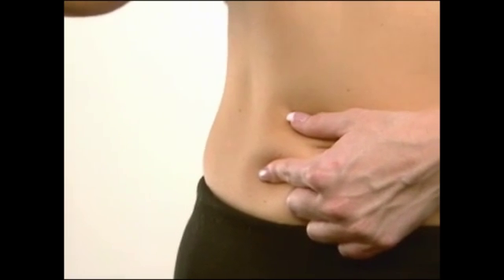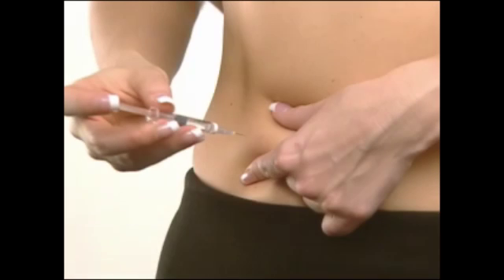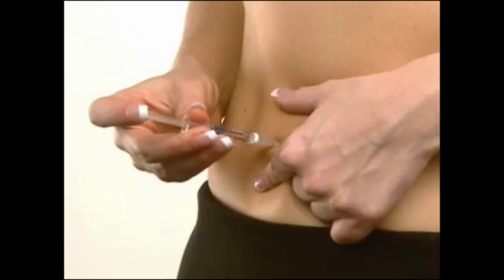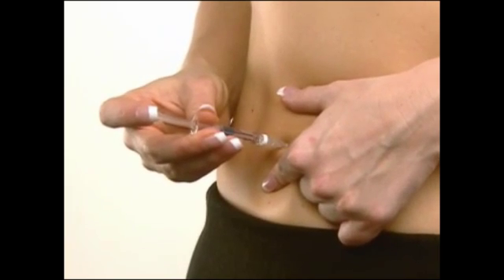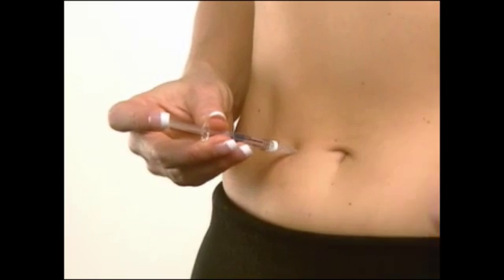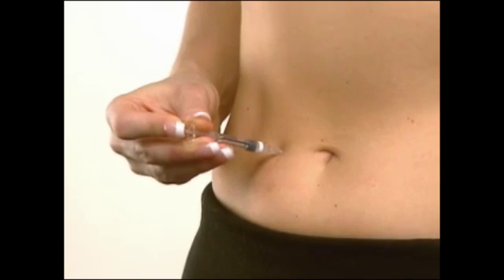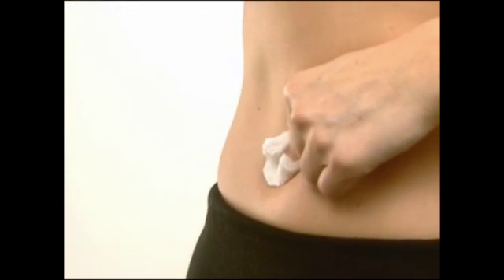Uncap the injection syringe. Hold the syringe in one hand the way you would hold a pencil. With the other hand, pinch the skin around the injection site. Insert the entire length of the needle completely straight into the skin at a 90-degree angle. Once the needle is inserted, you may release the pinched skin and push the plunger in a slow, steady motion until all the medication is injected. Gently withdraw the needle and apply pressure to the injection site with a sterile gauze pad.